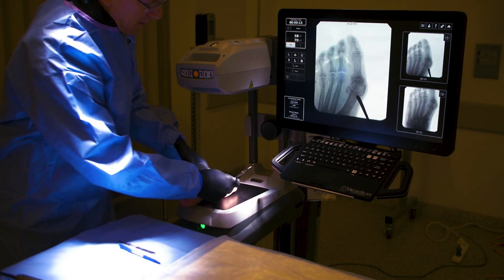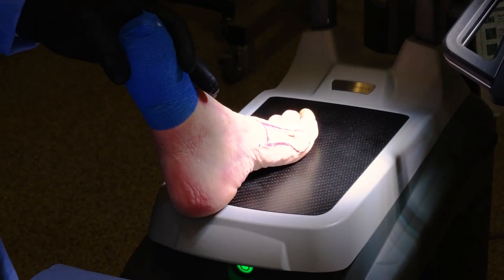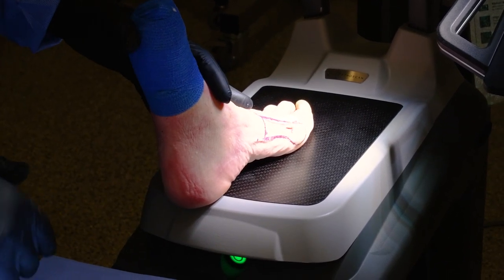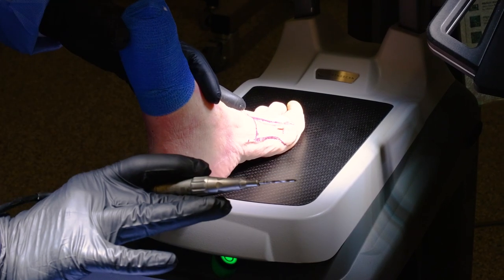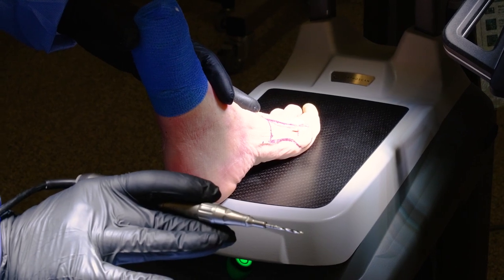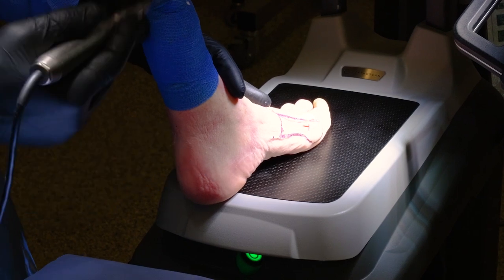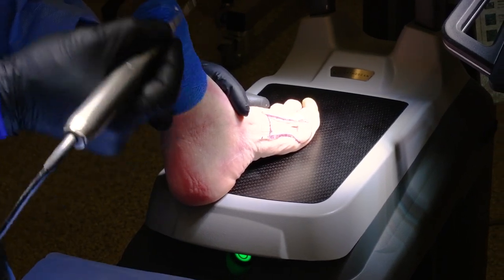I'm going to come to the medial wall but not go underneath, because I do not want to destroy the blood supply to the metatarsal head. Now this is our burr — it's a cutting burr, 20 millimeter, 2 millimeters — and I would have saline cooling. I'm going to do this with no tourniquet; I want the blood to cool the bone.